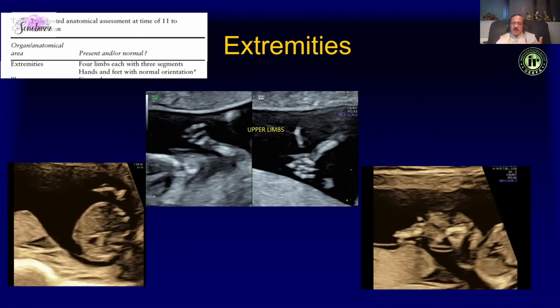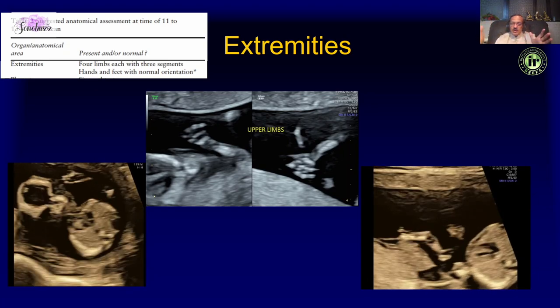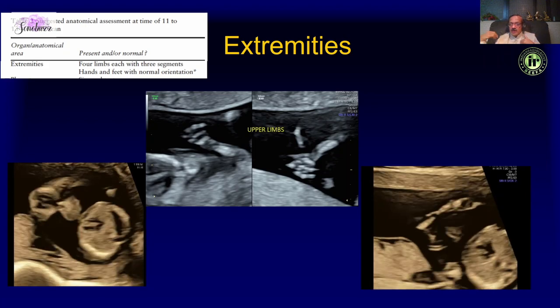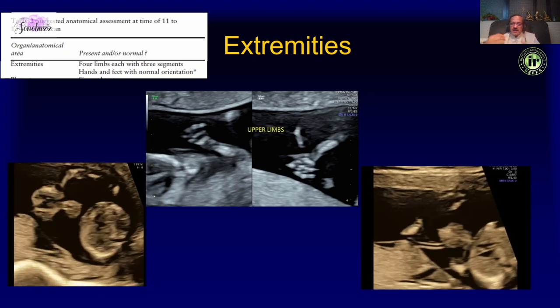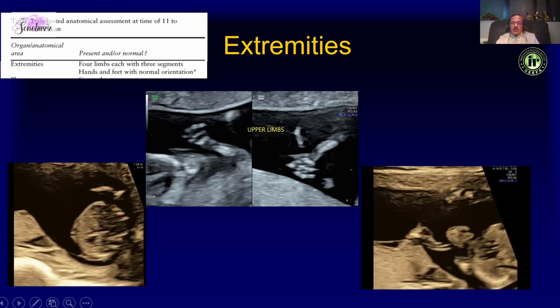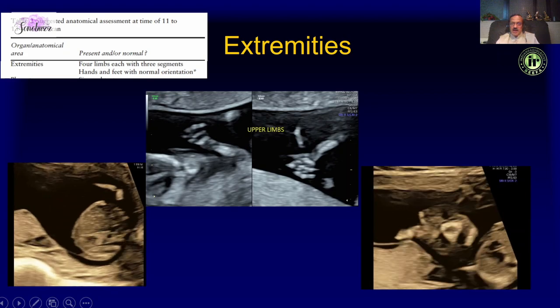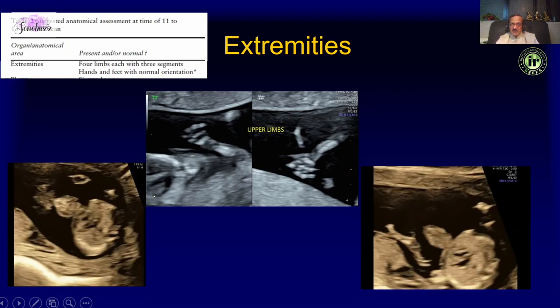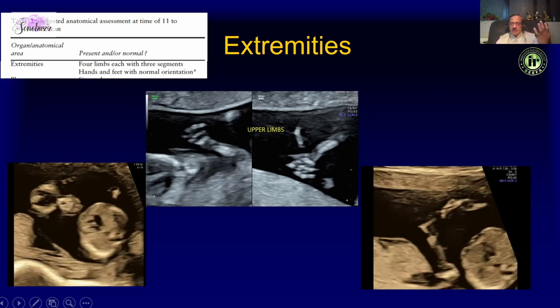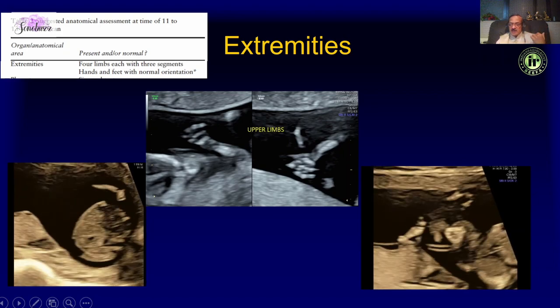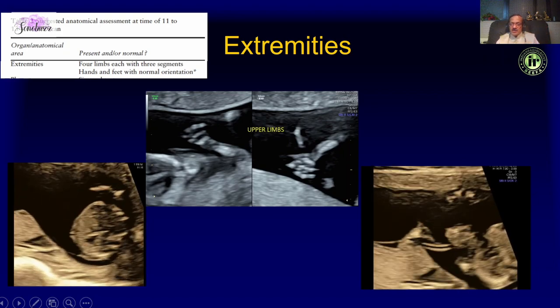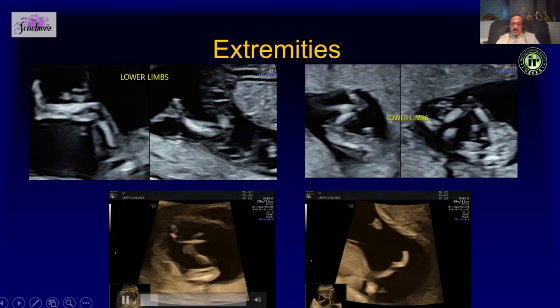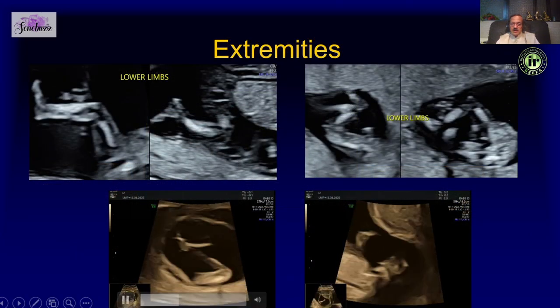Look at the extremities — it is actually easier to assess the extremities in the first trimester because you get an overall glimpse in one view, whereas in the second trimester a limb may be hiding behind the baby. Make sure you see four limbs and each has three segments. You can also see the hands clearly in most fetuses.